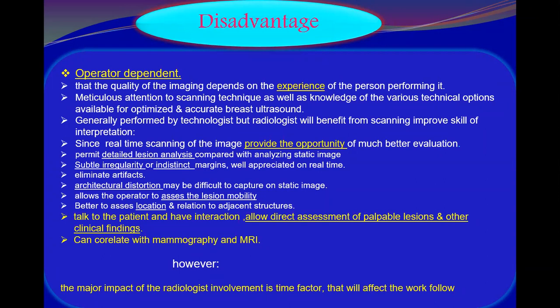And as we mentioned, it is interactive, so you can talk to the patient. You make sure, is it tender, not tender, that you are talking about the same lesion. This is the clinical concern or the patient concern. It is the same as the lesion on mammography and the lesion you have seen. You are talking about all these things if you are scanning the patient yourself, not just looking at a static image in the PACS system to be reported. And definitely it will be easier for you to correlate what you have seen on ultrasound with what you have seen on mammography and MRI, a capability that will be difficult for the technologist.